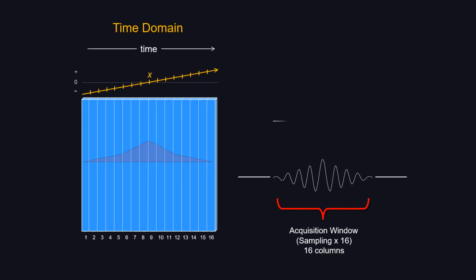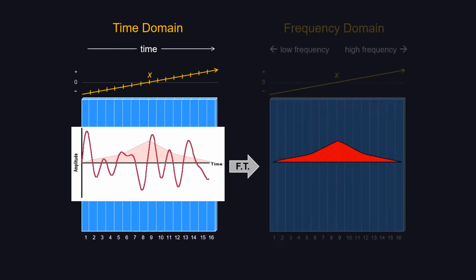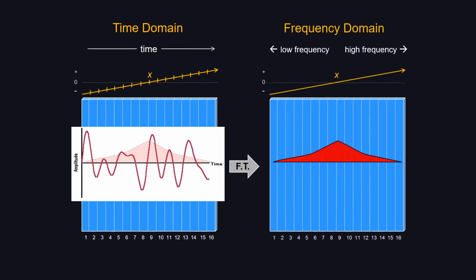You're sampling from time 0 all the way across an echo. So the frequency gradient is turned on, and each column consists of different frequencies, from low frequency to high frequency. When the signals come back, they come back as one summation complex signal wave. So we need to find a way to break this complex signal wave into its component frequencies. So we do Fourier transform. After you do a Fourier transform, you can break them into their individual component frequencies.